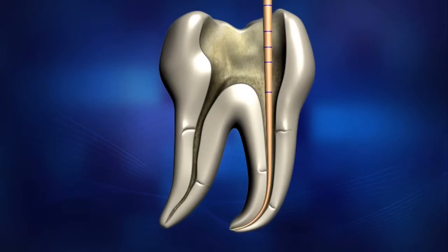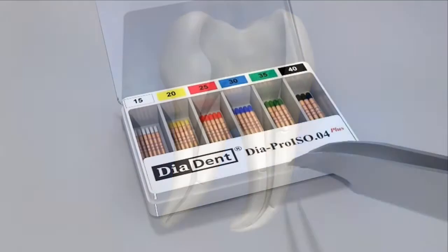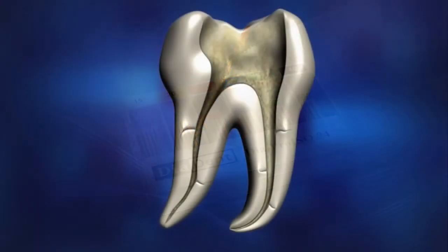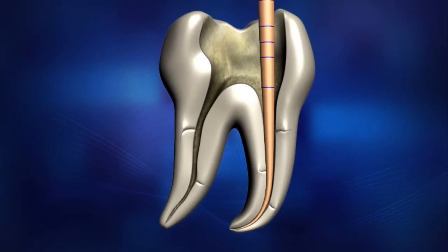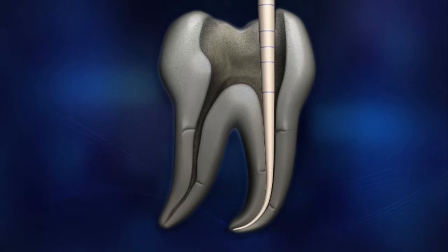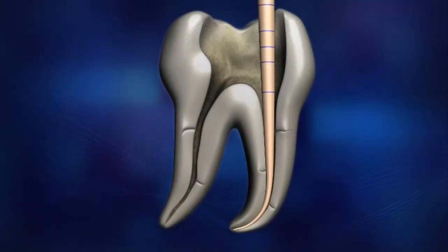After shaping the root canal, select a master cone that closely matches the apical size. Insert the selected Gutta-Percha point. Make sure that the selected Gutta-Percha fits snugly in the canal, and establish that there is a tug back at its apical extent. Take an X-ray to verify the fit.